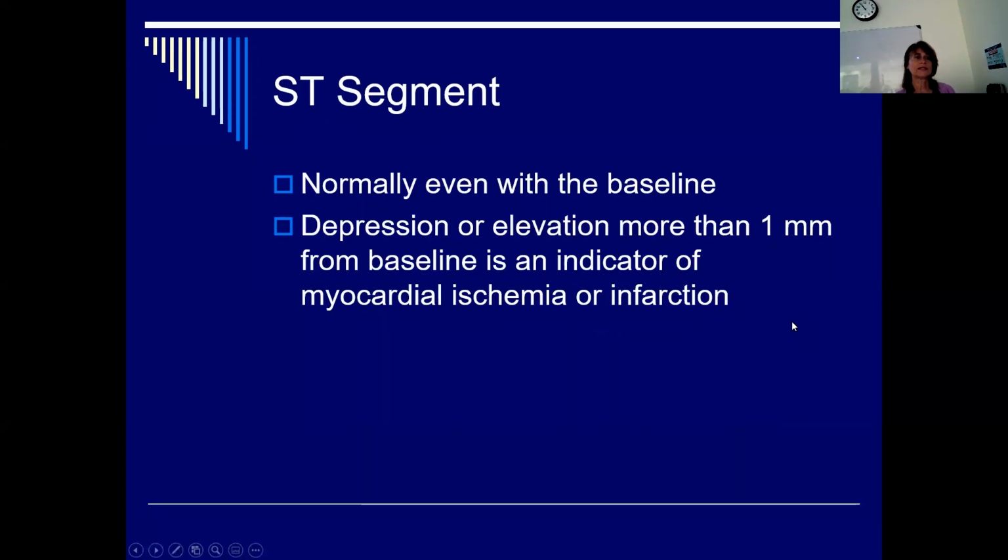And the next is the ST segment. The ST segment is normally even with the baseline. If it's depressed or below the baseline or elevated above the baseline more than 1 millimeter, and 1 millimeter is one little box, it's an indicator of myocardial ischemia or myocardial infarction.